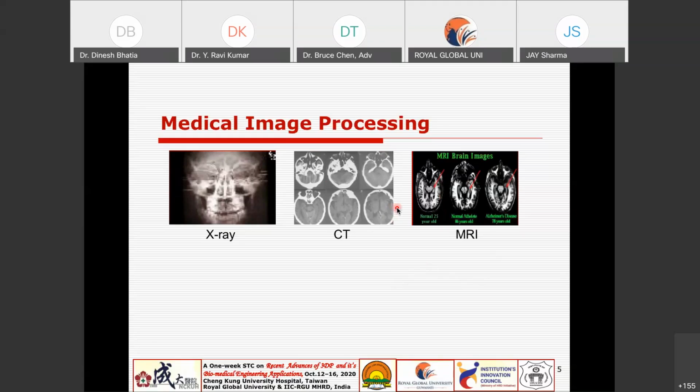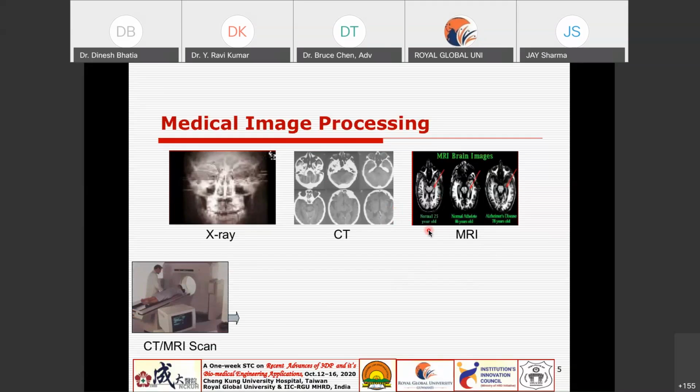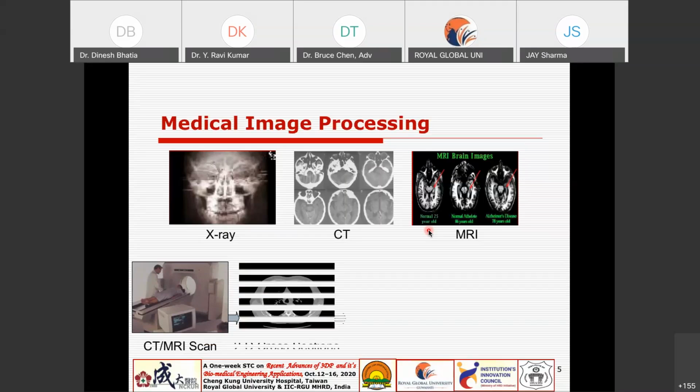You can start your journey of medical 3D printing with any one of these data. It need not be CT or MRI. It can be a PET, or any other modality which you come across, but you bring it into a DICOM format. That is a more neutral format, which you can work on with these medical image processing tools.